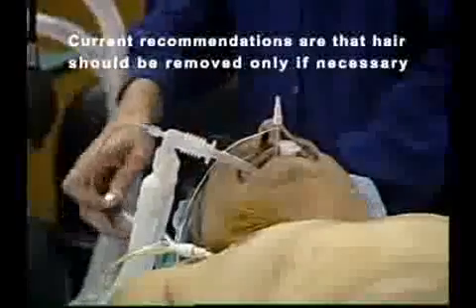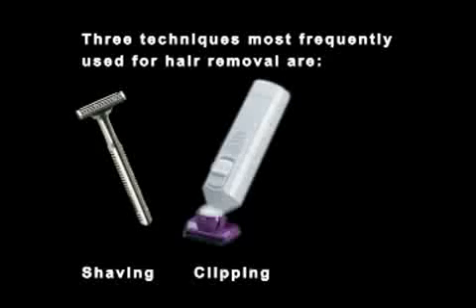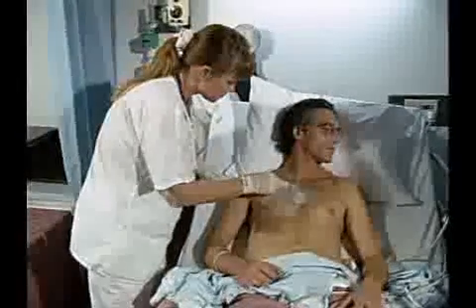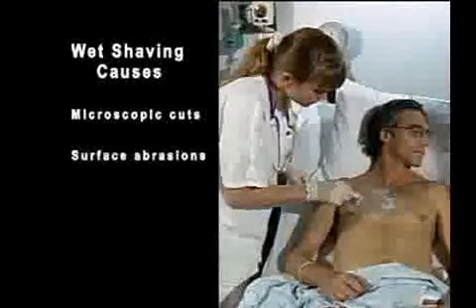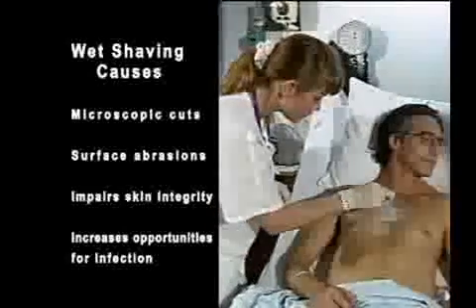Although many surgeons still prefer that hair be removed from the surgical site, current recommendations are that hair should be removed only if necessary. The three techniques most frequently used for hair removal are shaving, clipping, and the use of a depilatory. Wet shaving is the most common and has the advantage of being easily and rapidly done; however, it causes microscopic cuts and surface abrasions which impair skin integrity and increase the opportunities for infection.